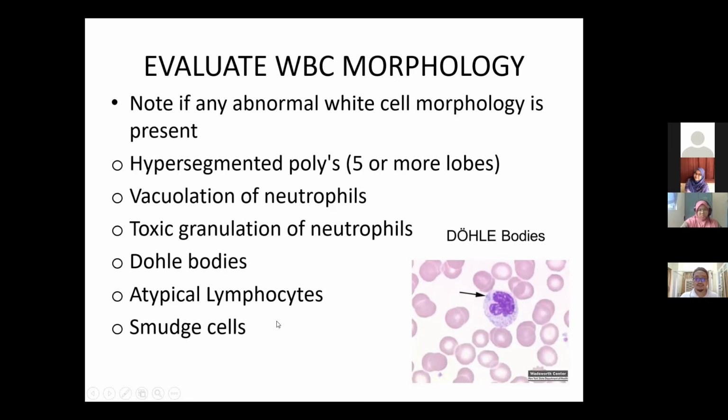And then atypical lymphocytes, smudge cells, etc. There's a lot of it. We will show you the slide at the end of this presentation. Okay.